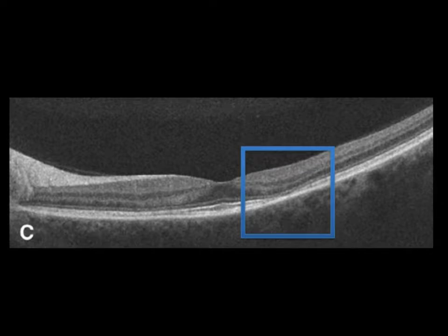Now what you can see after I've actually brought it to your attention is that when you're looking at the outer segment of the photoreceptor cells, or essentially the photoreceptor integrity line, it actually is absent in the area that's in the blue box. Again, compare the area to the left and to the right of the blue box where you can actually see the RPE, which is the most outer portion of the measurement. You can actually see the outer segment of the photoreceptor cells. But again, then when you enter into that blue box, it's almost absent. It's like somebody took an eraser and actually tried to rub it out.